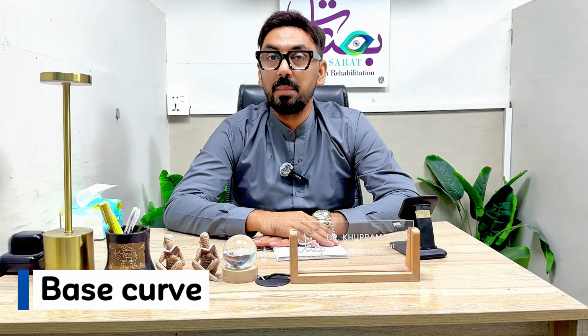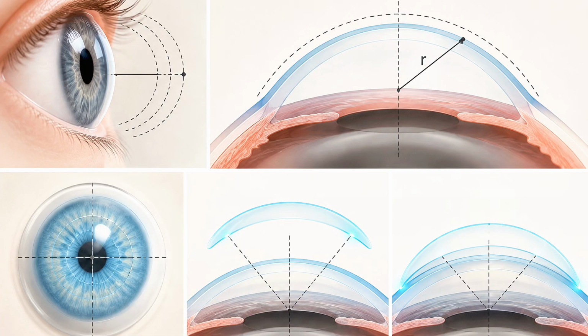The first parameter, which is very important, is called the base curve. Base curve is actually the radius of curvature of the posterior and central surface of the contact lens. So this is called the base curve of the RGP lenses. I will segregate the base curve of the RGP lens into two different categories.